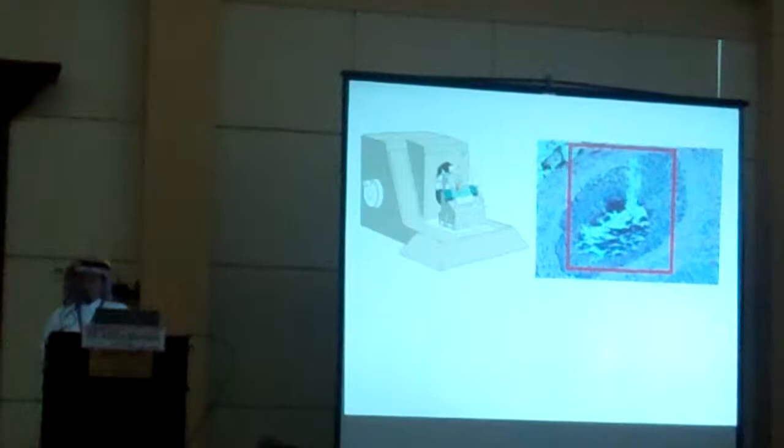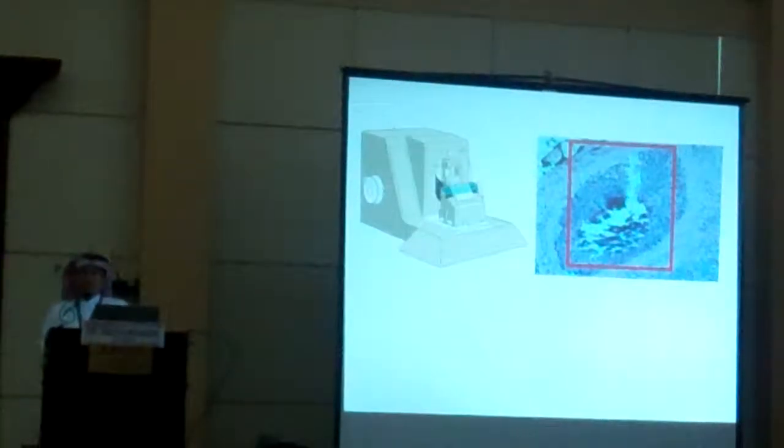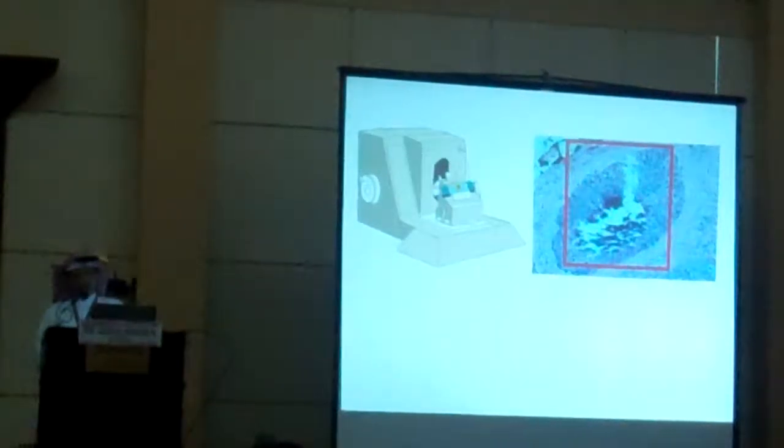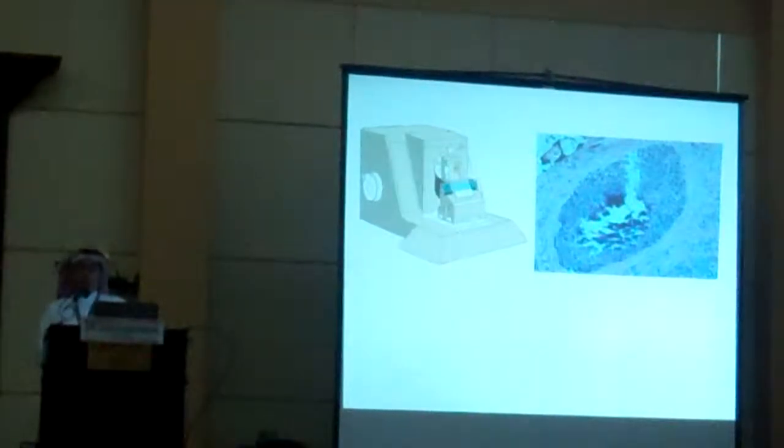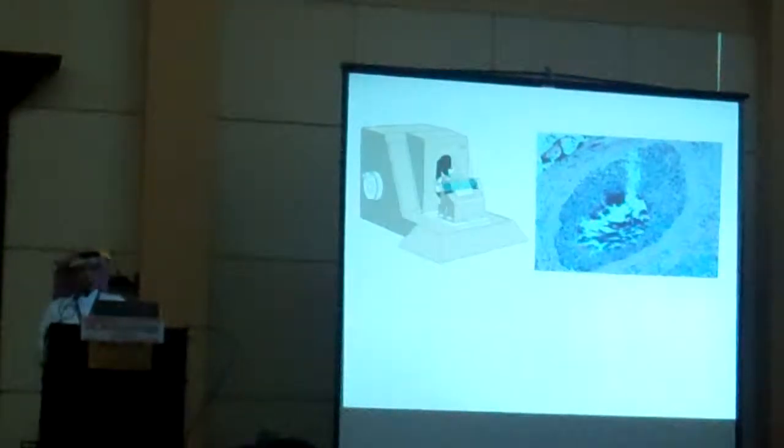So if they are not seeing microcalcification, ask them, did you cut deeper levels? Did you cut more? And if not, then they have to see microcalcification. And also that microcalcification really goes with what you are seeing radiologically. It's luminal and it's clustered based on your findings.